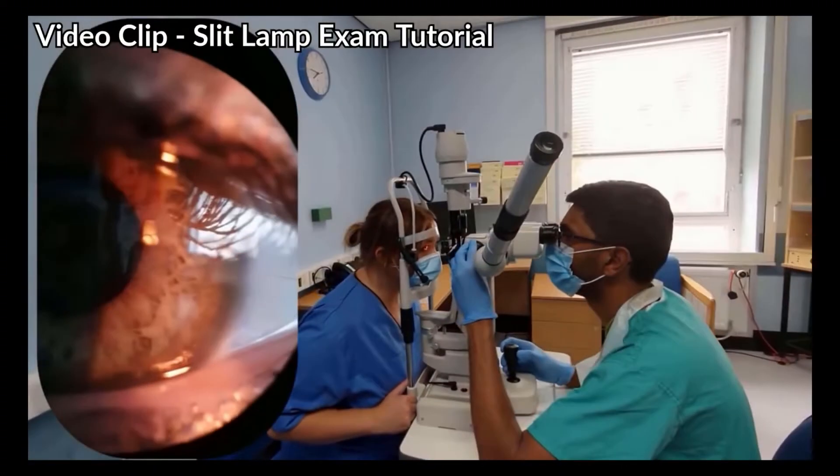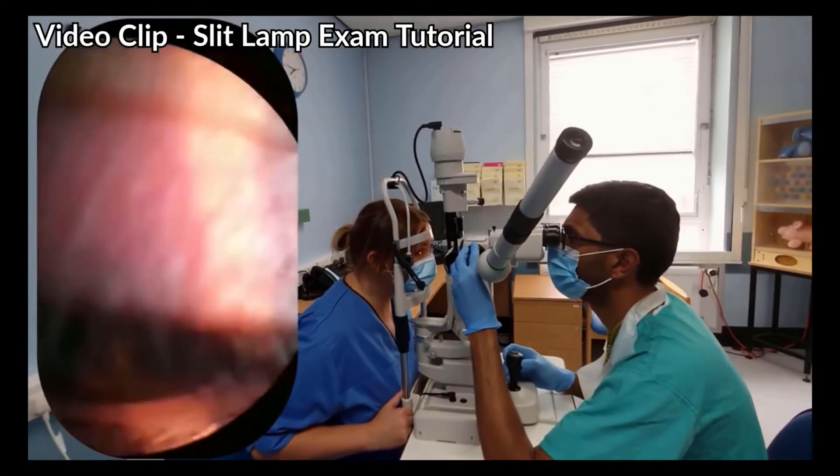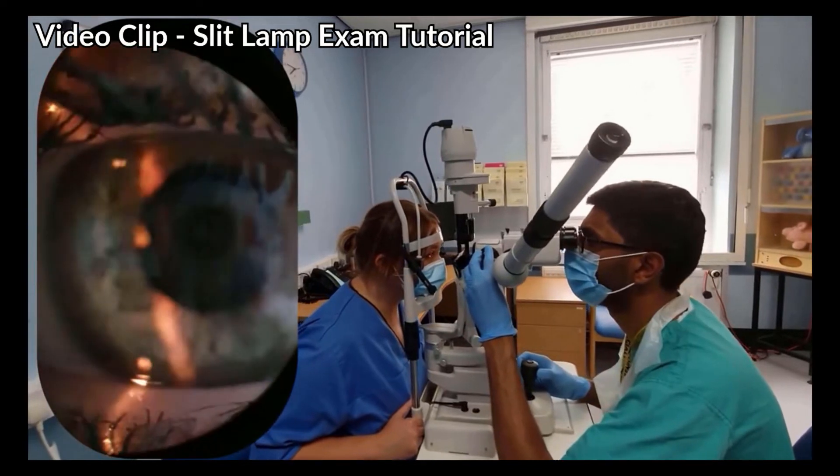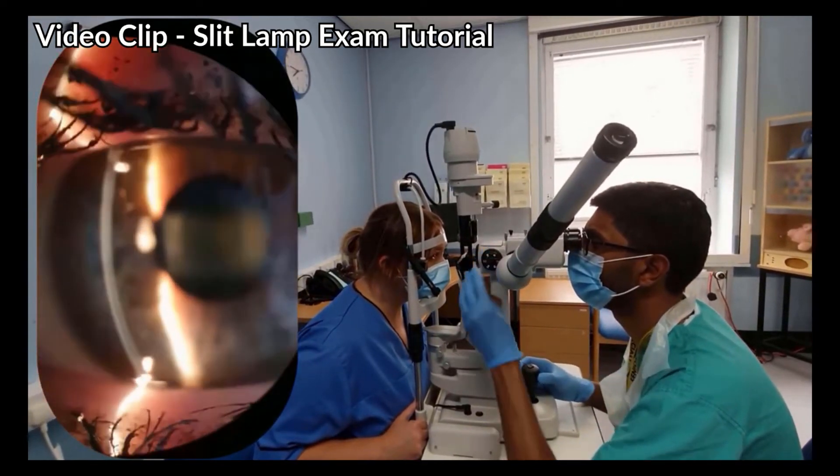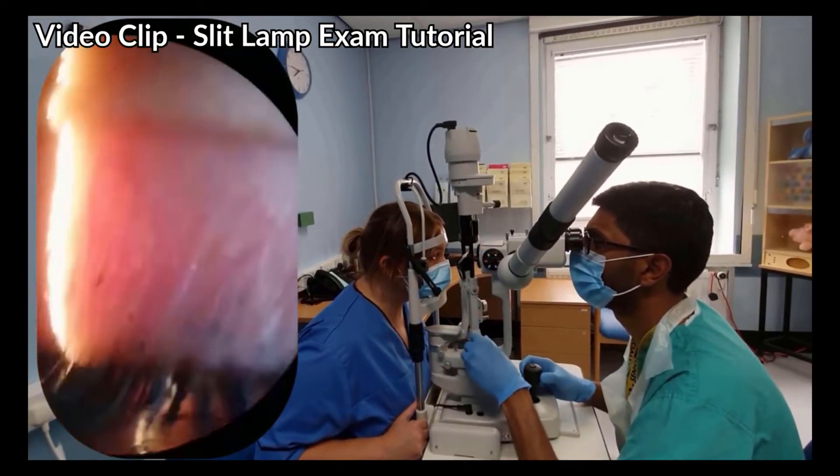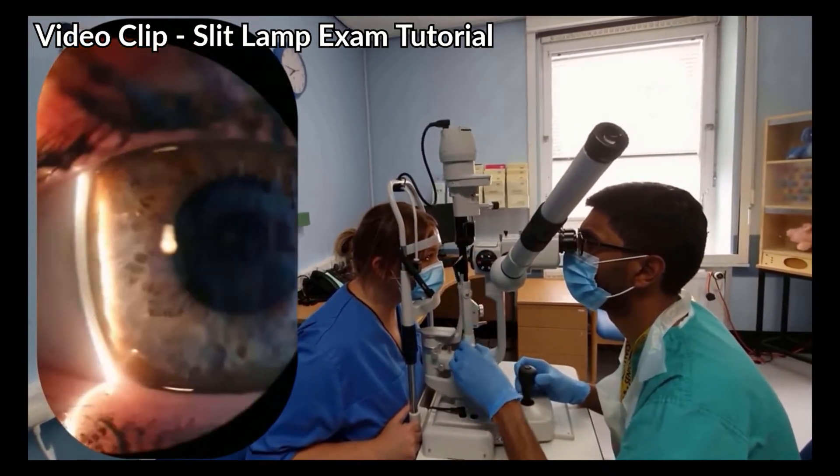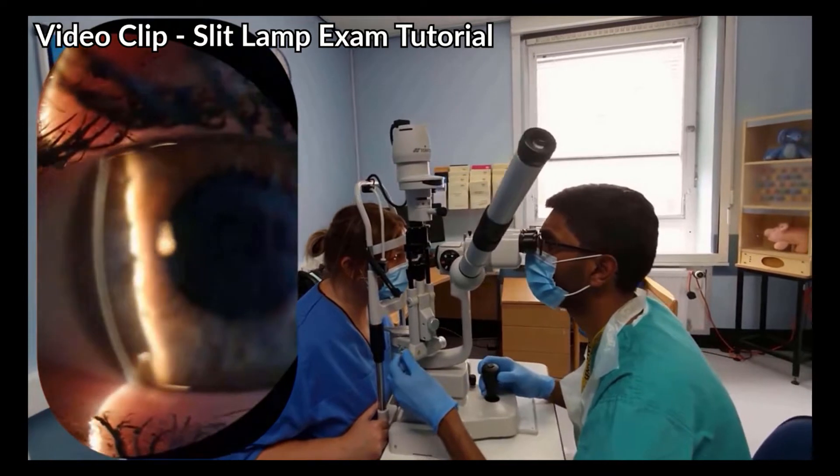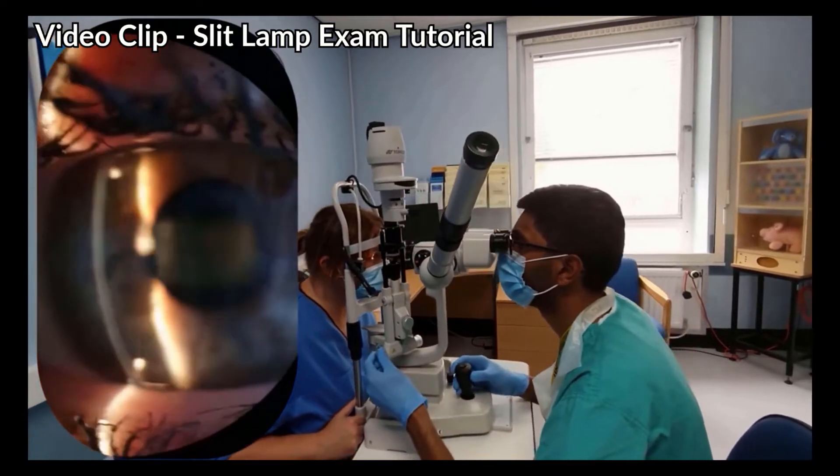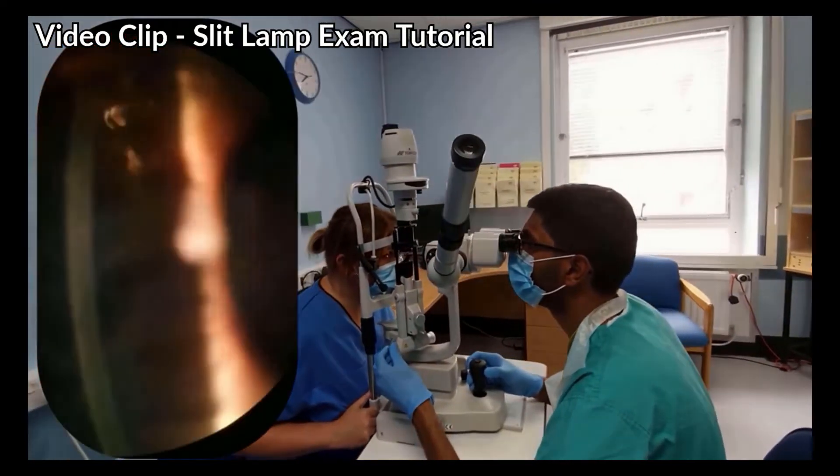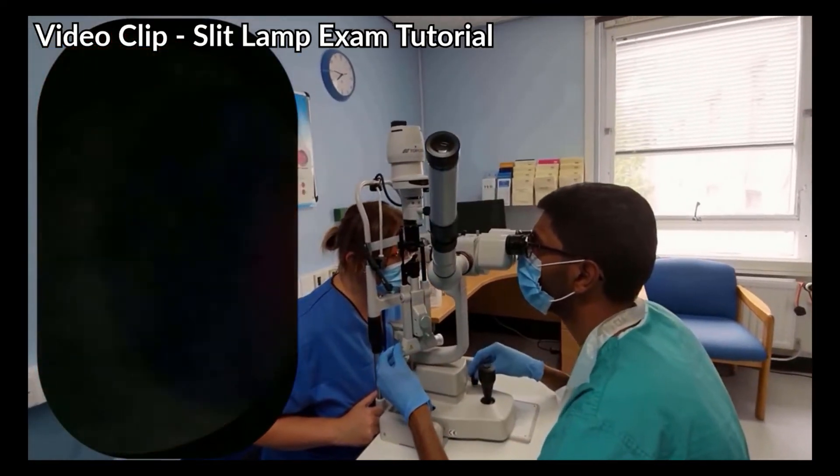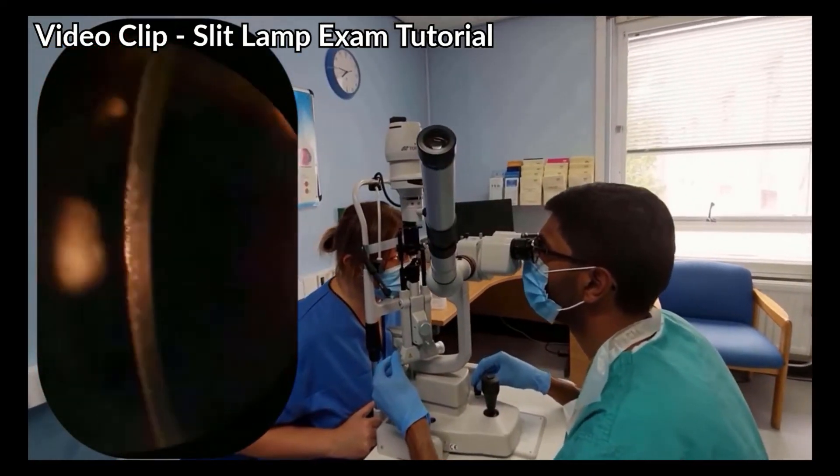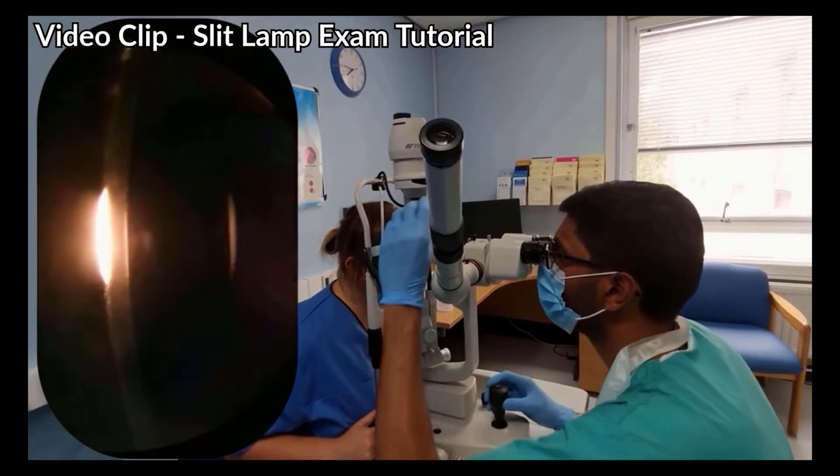And then turn the brightness up. You should see a cross section of the cornea. In clinical practice, you can increase the magnification and you should be able to visualize the different layers such as the epithelium, stroma and endothelium as shown here.